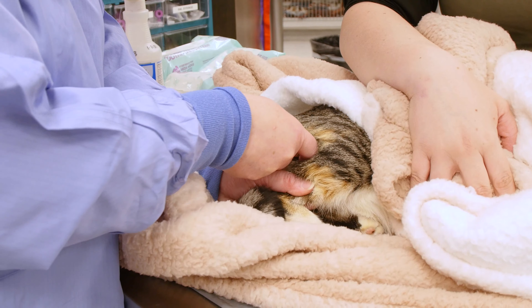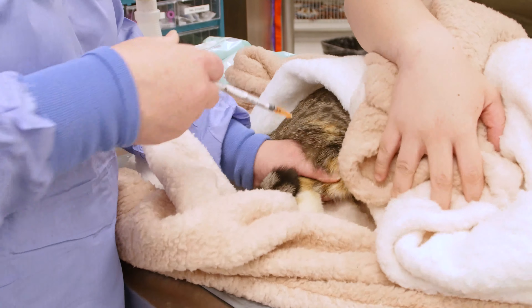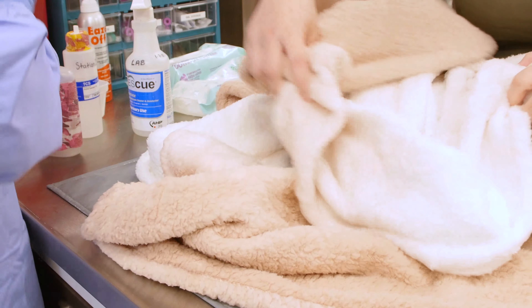Each anesthetic protocol is tailored specifically for your pet. The sedation will be administered, which will allow us to use less anesthetic medications during the procedure.